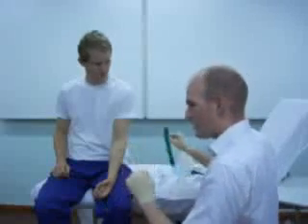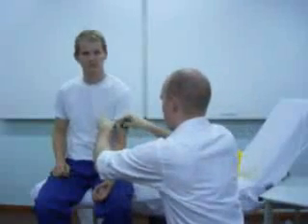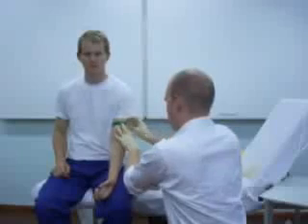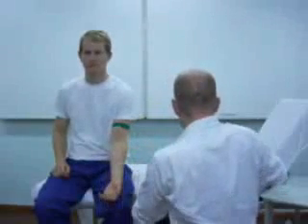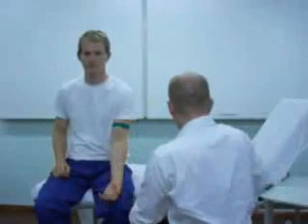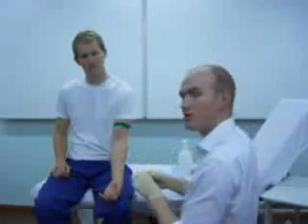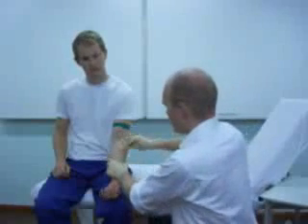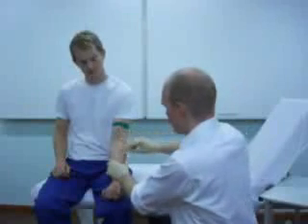Moving on to it, wearing gloves obviously. First thing to do is to put the tourniquet around the patient's arm. For this, I'm going to use a vein in the antecubital fossa, nice and easy to access. We've got all our equipment here, including a sharps bin. I'm just going to clean this area now using a sterile cloth.